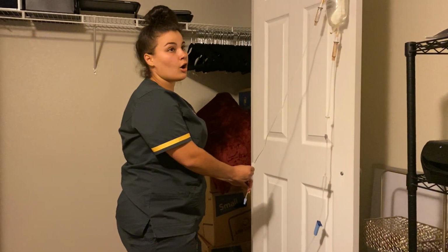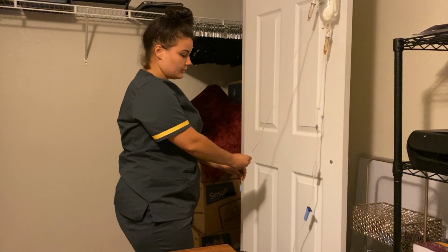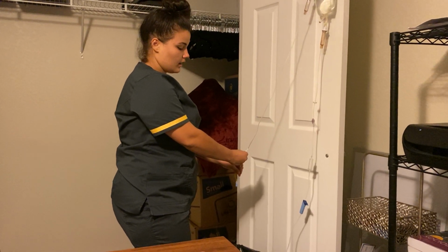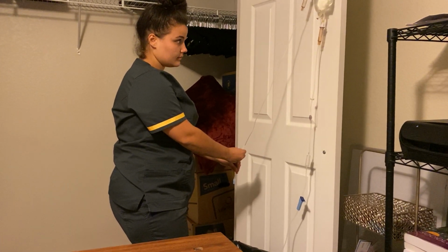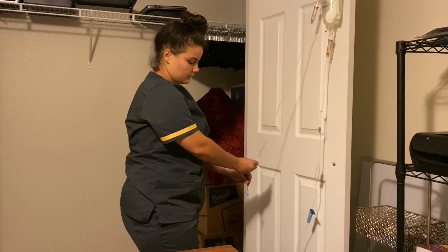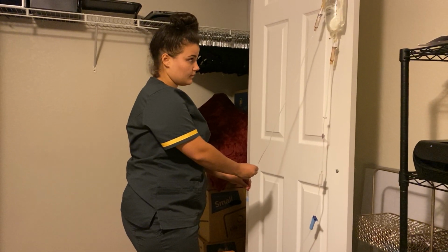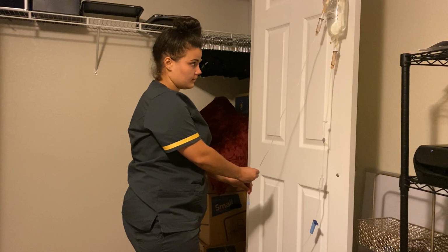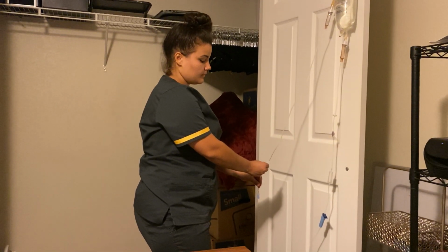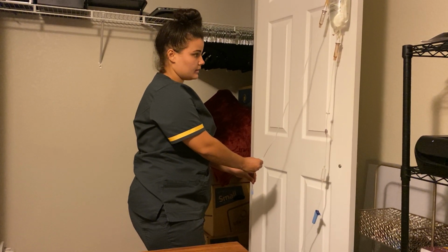Now, when I go to prime it, I'm going to do it very slowly. I'm getting basically all of the air bubbles out. But I'm going to do it very slowly, to where not a lot of my medication is wasted. You see the air bubble is coming down.